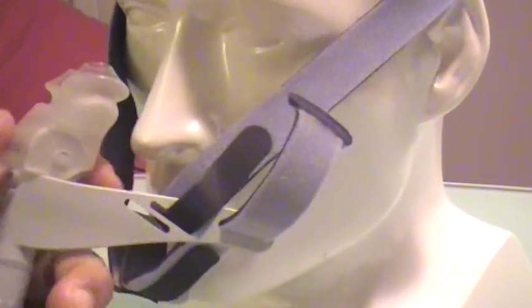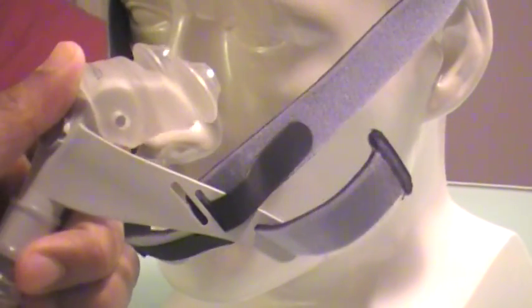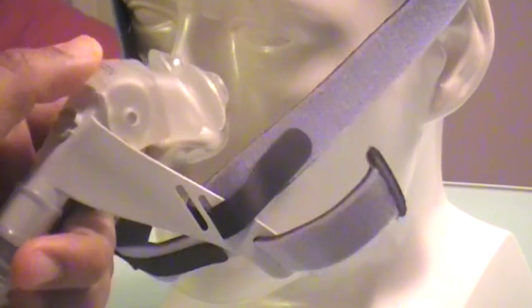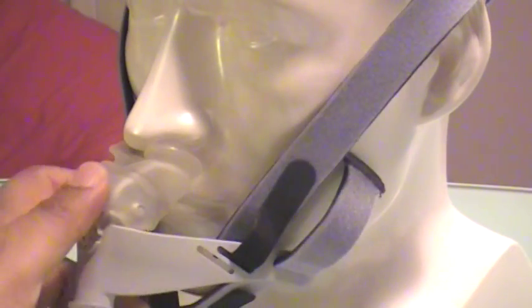These pillows can be rotated. You see how I'm doing it with my thumb? This is how you angle it. You see how I'm pushing it to enter your nostril.